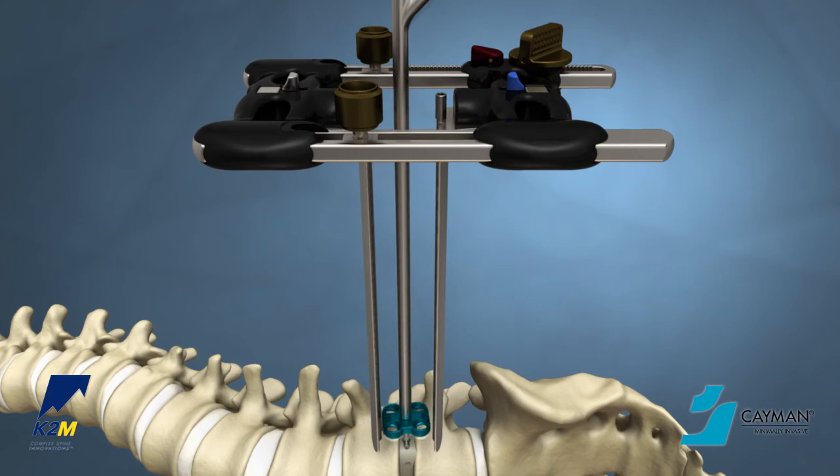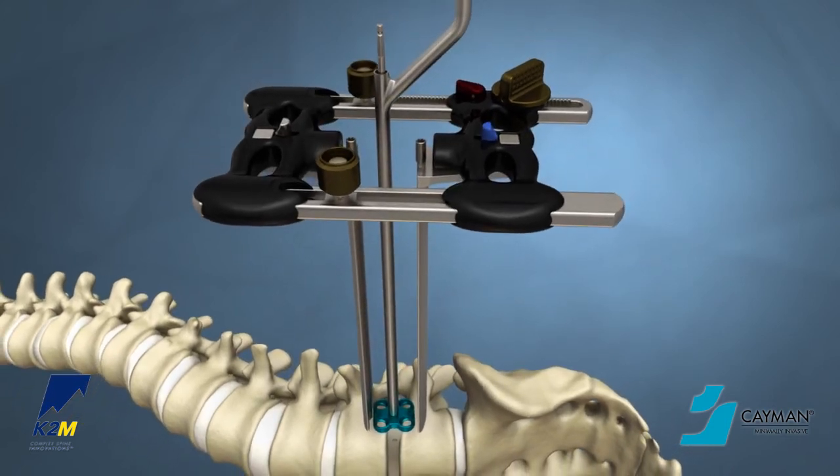When the desired plate is chosen, use the center plate holder to properly position the plate on the anatomy.